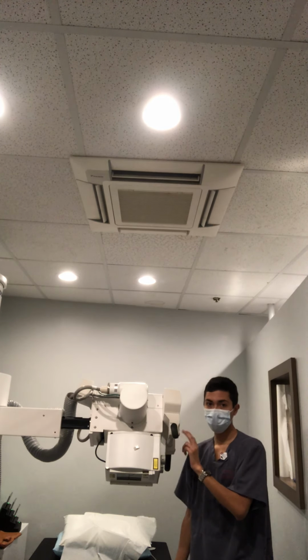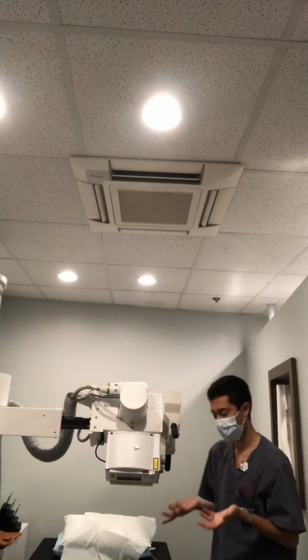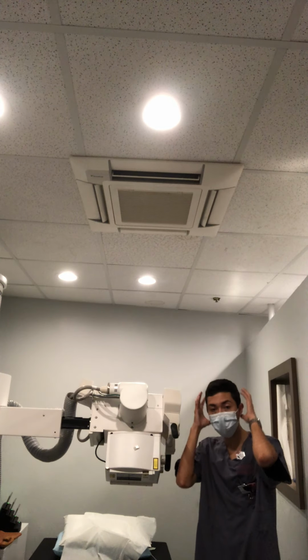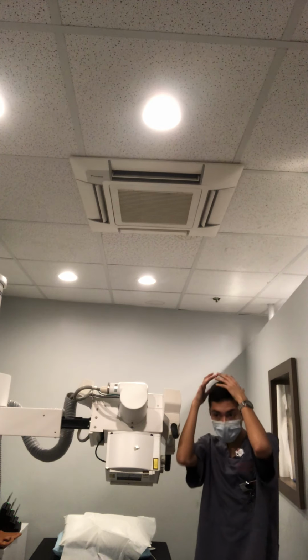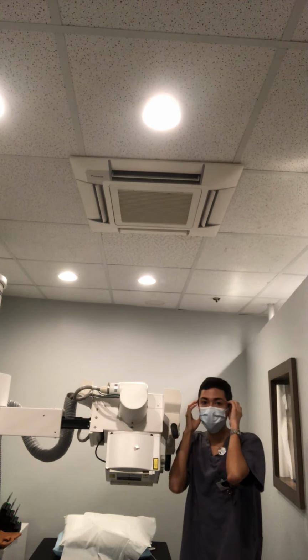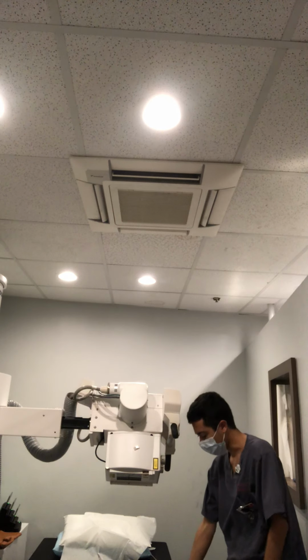Okay. You have to use 25 to 30 degree caudad. You have to. Okay. SID is 40, because you wouldn't put in a 72 SID. That doesn't make sense. Collimation to where? Okay, so slightly above the EAM. But you have to include part of the skull, because that's basically, it's kind of like right here, right? So you got to include just a little bit. You can't just collimate too much to see the fossa. You know what I mean? You got to make sure there's some anatomy. You see the lateral margins, a little bit of the orbital ridges, stuff like that.